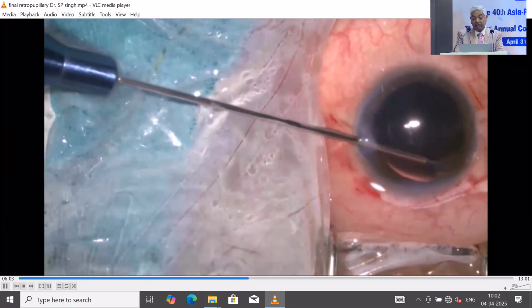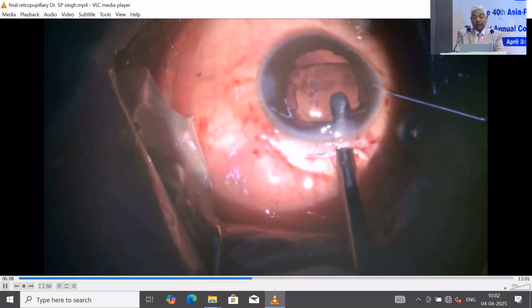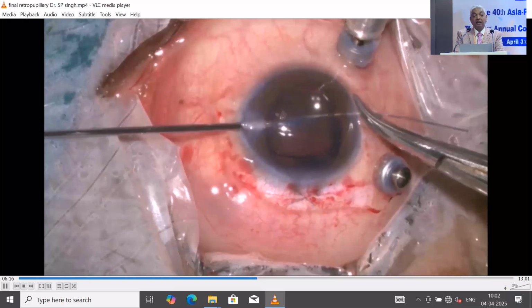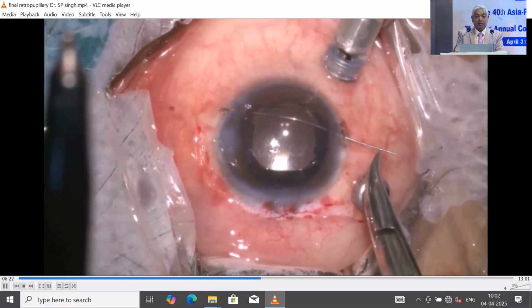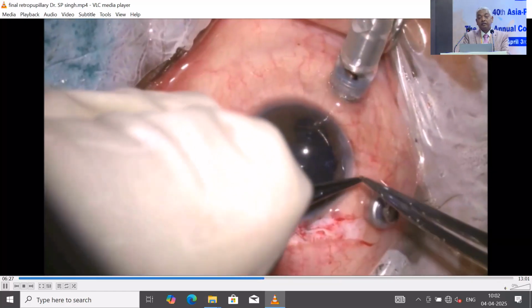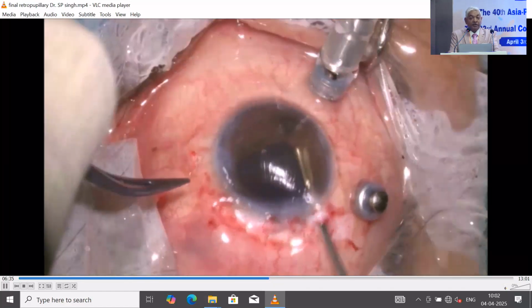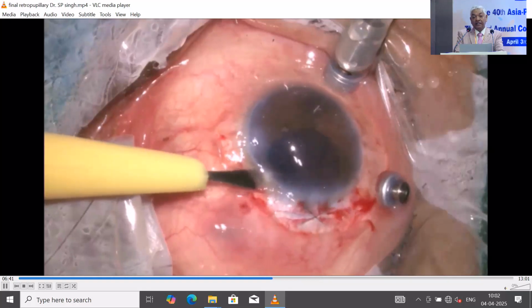Even in such a dilated pupil, I am going to implant again. You can see, because the inclination takes it mid periphery, you can implant very well even in such a dilated pupil. After that, there are different techniques. One popularized by Dr. Amar Agarwal is single pass four throw pupilloplasty, in which you make paracentesis at different places and pass polypropylene 10-0 sutures, and you can see how you can repair this dilated pupil.